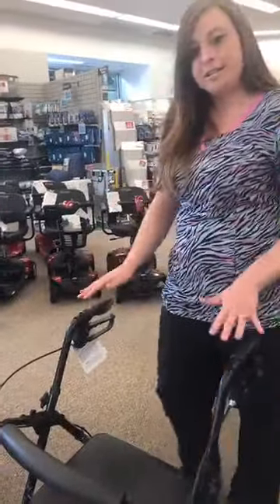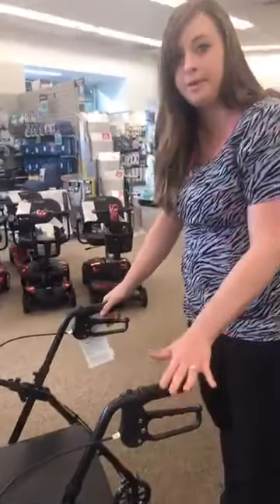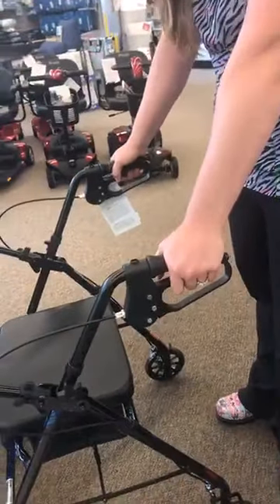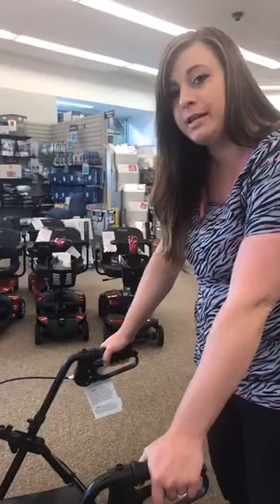So once you have your adjustments made, another big factor about rollators that people need to remember when using them: you have brakes right here. They're kind of like a bicycle brake. You can squeeze them to temporarily brake them. So if you hit a slight hill and you want to put the brakes on a little bit so it doesn't get away from you, you can squeeze them.